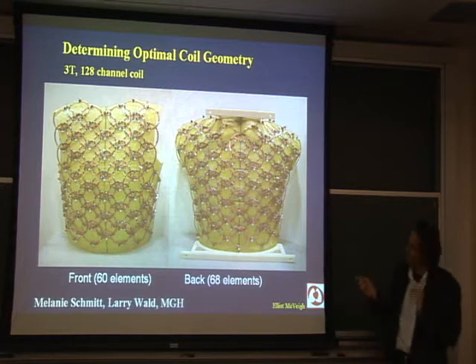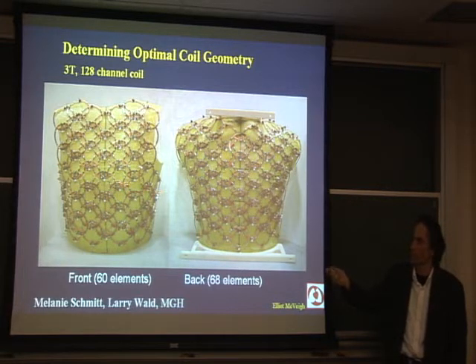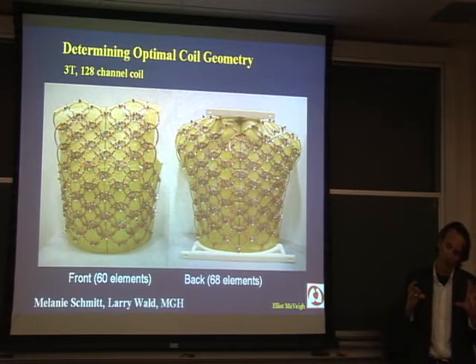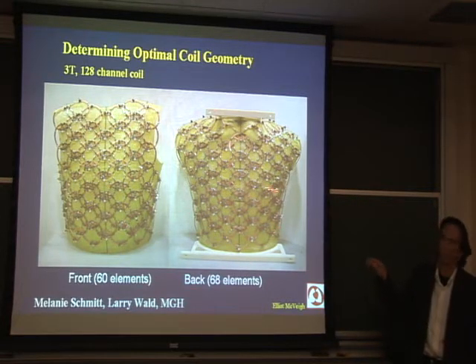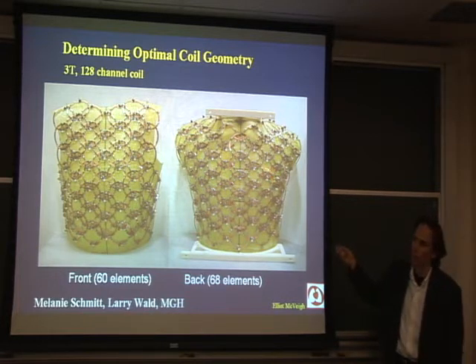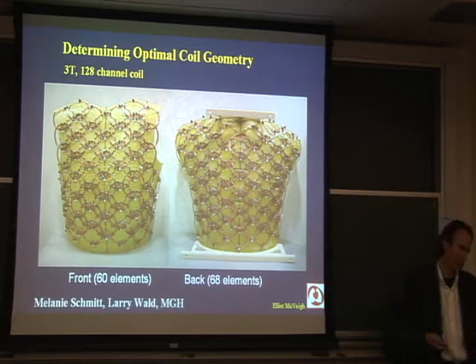To use this really efficiently, you want to do 3D images. You want to accelerate your acquisition in this direction, and accelerate it by at least 2, to get to a factor of 10 increase in data. If all you're doing is a slice, you can get about a factor of 3 to 4 increase in data acquisition. It doesn't really matter that I have coils down here if my slice is through the heart like this. If you have great flexibility, essentially what you should be able to do is pick the slice interactively, and then the system decides which coils to choose.